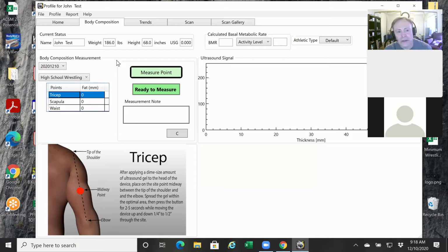Last but not least, the optimal duration of the measurement: three to four seconds tops. I'm going to guide you through exactly how I do this, show you the most efficient way to do it, and we'll talk about the second component that's going to ensure your success with accuracy with this thing. The first being those four things I had you write down.